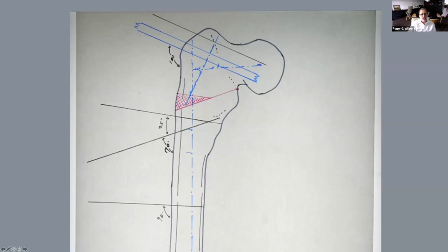So you can use a sterile goniometer, and I highly recommend that you have a stainless steel sterile goniometer intraoperatively to place that pin. Now you want to have these pins in a location that's good for you for making the cuts. You want them close enough to where your osteotomy is going to be, but far enough away that they're not in your way when you go to work on either the chisel or when you go to make these cuts.